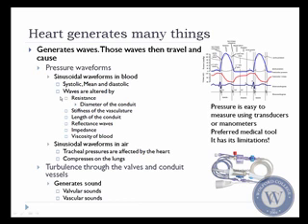What we're looking at with sinusoidal waveforms is that you can give them an amplitude, which gives you the top peak, which in this case we call systolic pressure, and the bottom peak, which is the diastolic pressure, and the mean in between these is considered the mean pressure. Of all the waveforms that are generated, the most accurate information can usually only be elucidated using the mean.